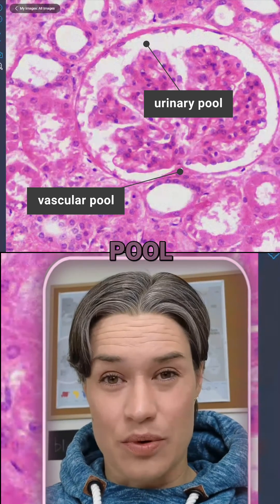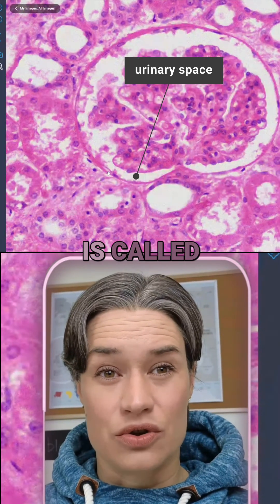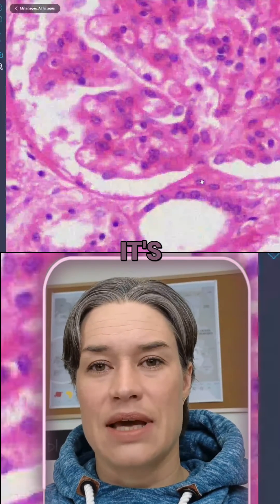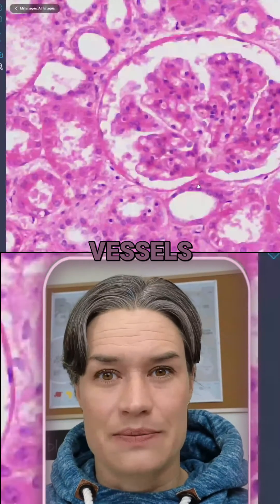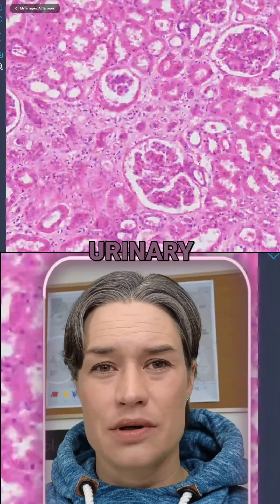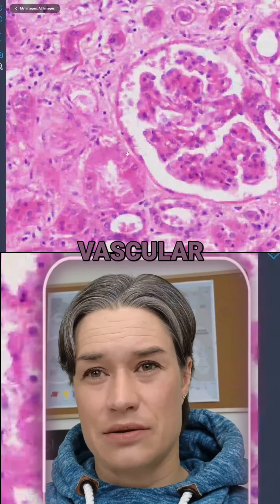The space here is called the urinary space. The vascular pole at the bottom is actually attached to blood vessels. We can see another beautiful example in other glomeruli — here you can clearly see the urinary pole and the vascular pole.